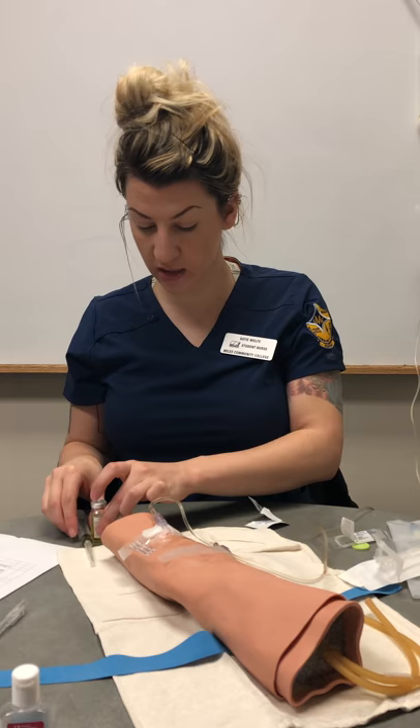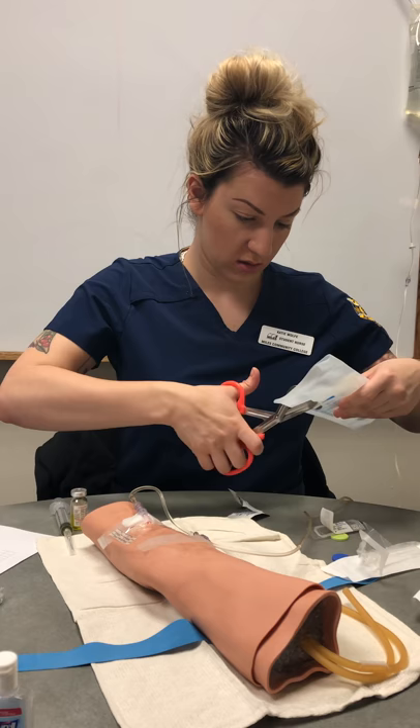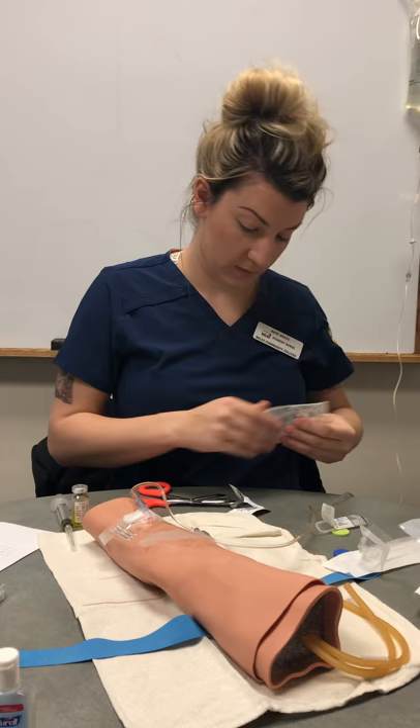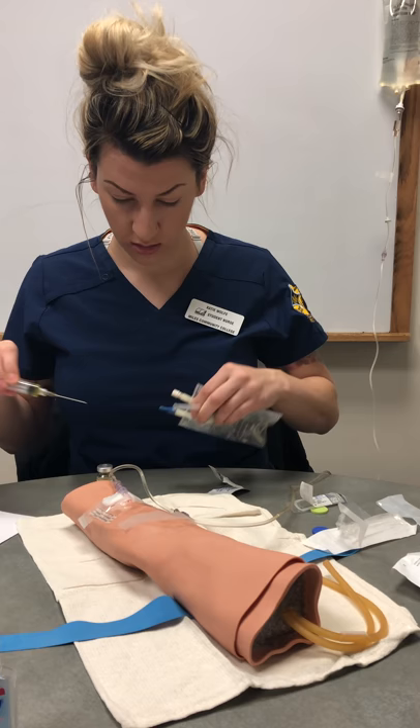Since we're just staying in the medication room, we don't need to label this — we can just put it next to our solution. We have sodium chloride 50 milliliters, expires August 2019, so it's good. We would inject it through this little port right here.